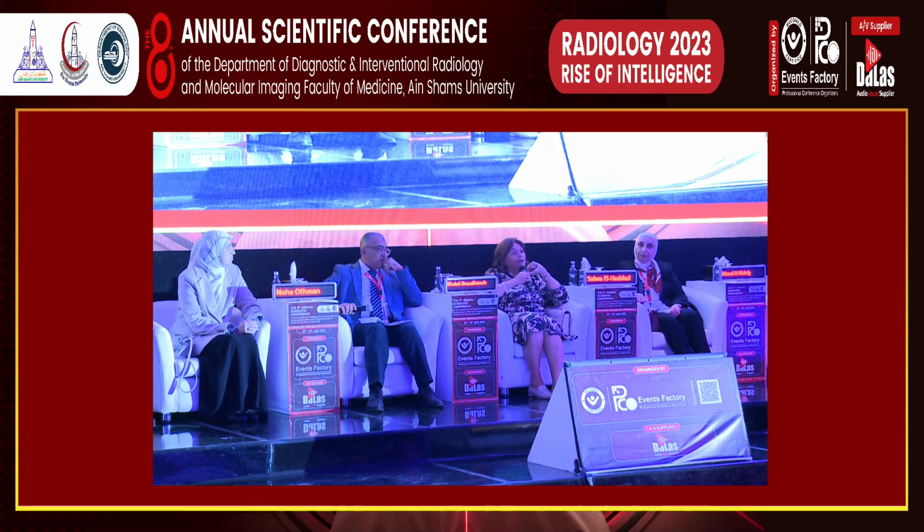Also with the orthopedic features, we go for the radiological features before signing out or before starting to diagnose the slides.